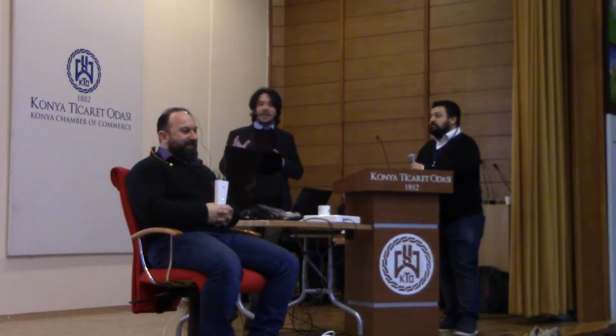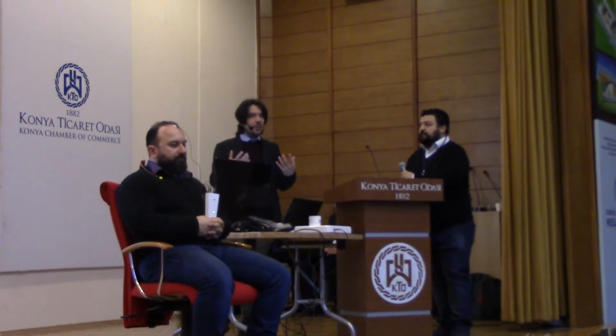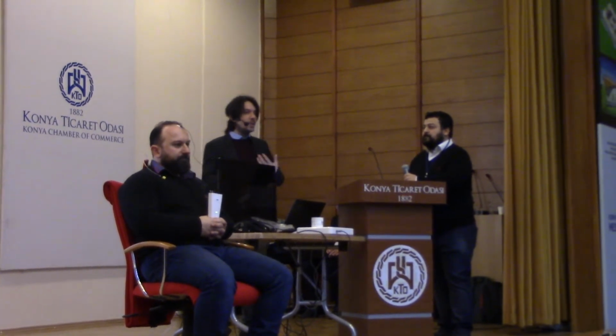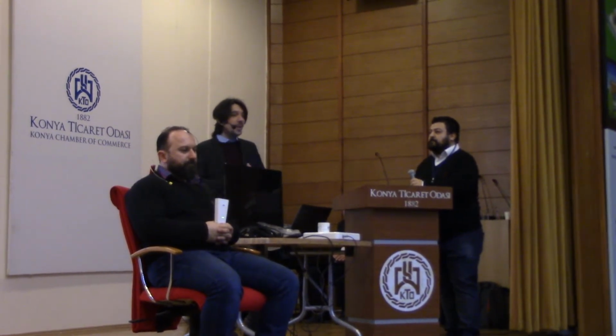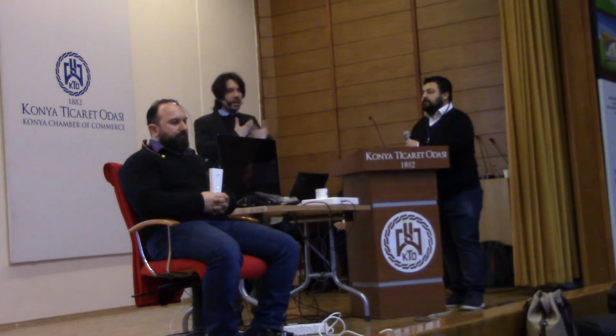Here we will see now a short part of definition and then a practical session. First of all, I take care of showing you both together, cervical and ocular VEMPs, to see the differences and the fact that ocular VEMPs are not so diffuse like cervical VEMPs in the clinical practice, but they are very important and they are complementary tests. Also, if you use video impulse test, the VEMPs are sisters and brothers because they all check different information.